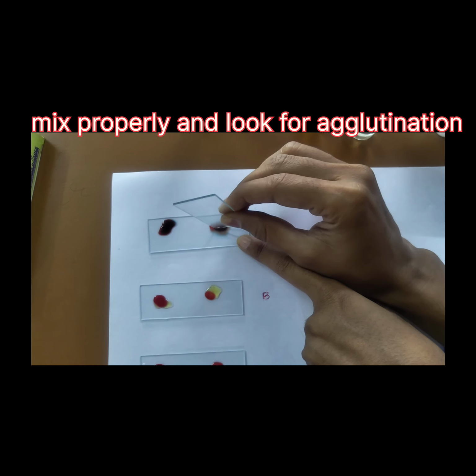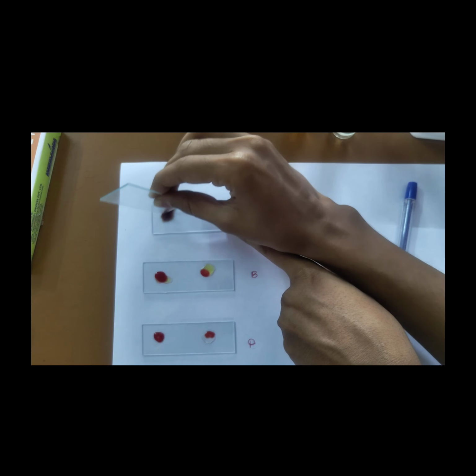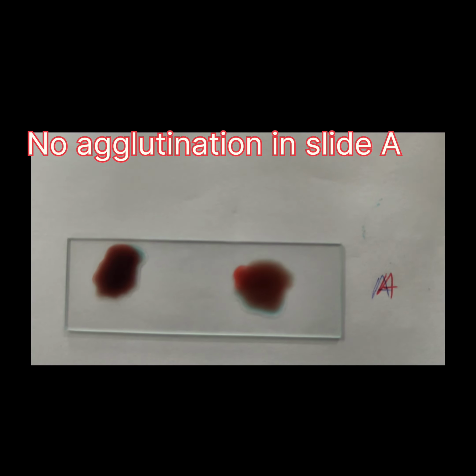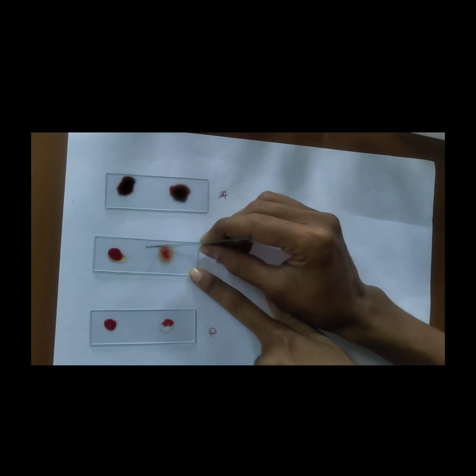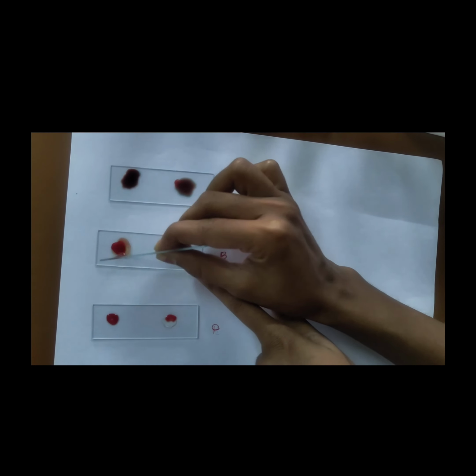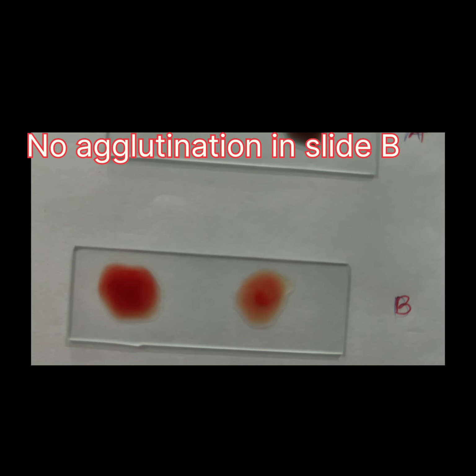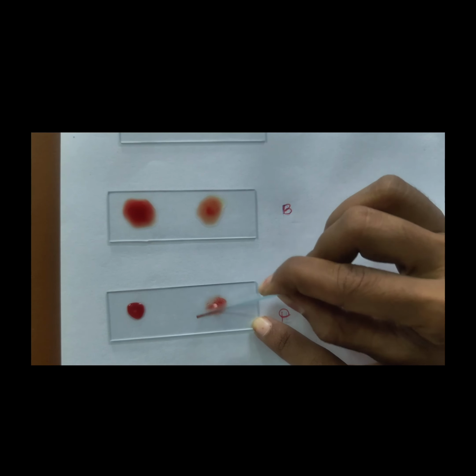Now mix antisera with your blood sample properly and look for the agglutination. Here in slide A we can see that blood mixed with the antisera and there is no clumping or no agglutination. Let's check for slide B. Here in slide B also we see that blood mixed with the antisera and there is no clumping or no agglutination. Let's check for the slide D.